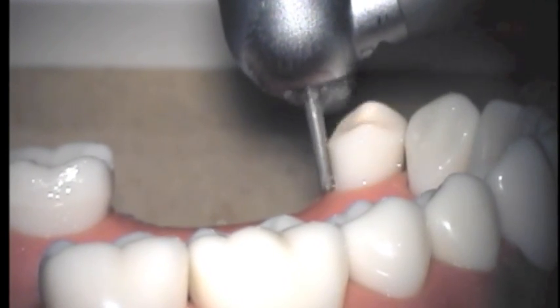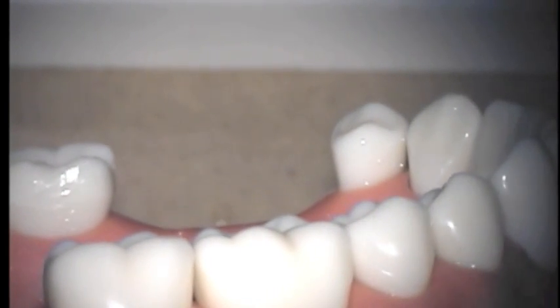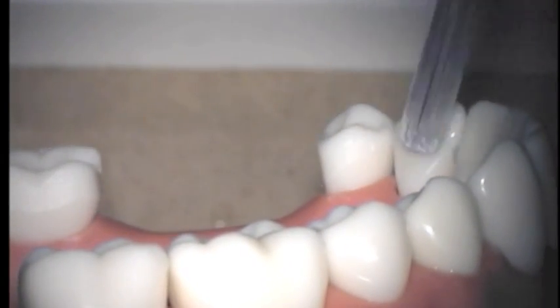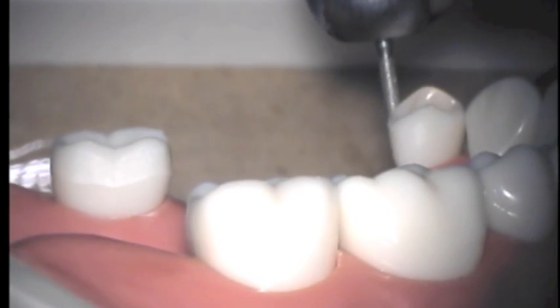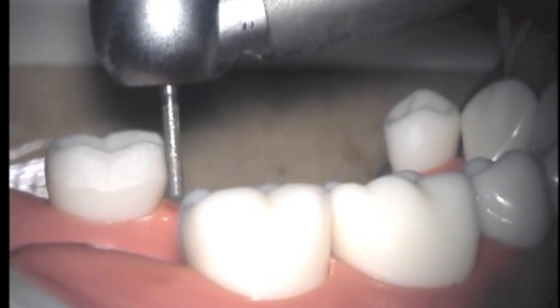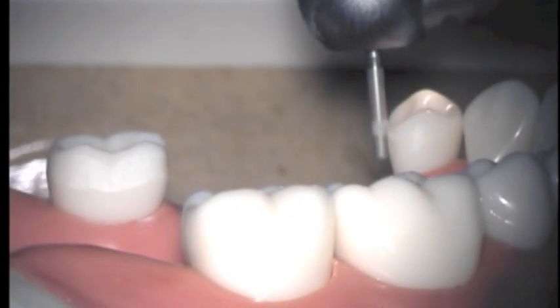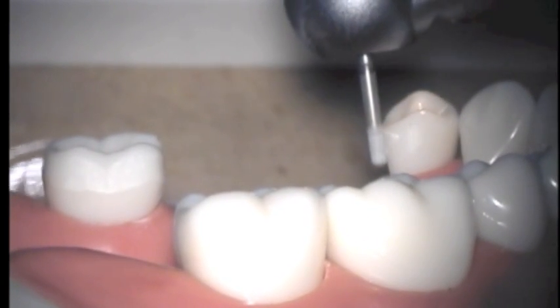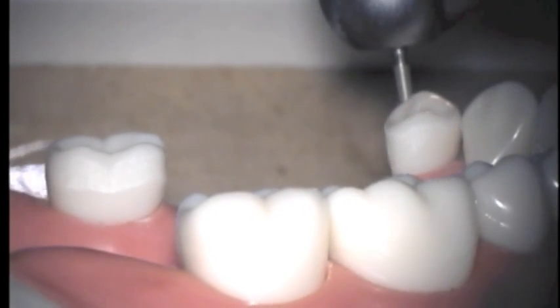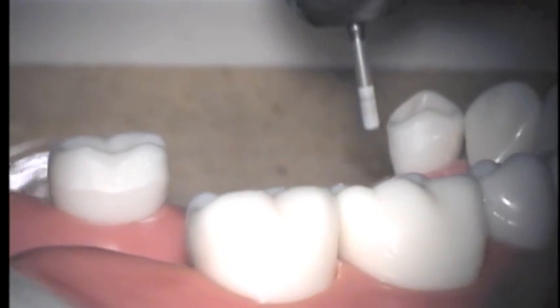Or you can use a similar technique to what we used on the first tooth. Once the teeth are prepared, do that for all the other abutments. If you're going to err, make sure that as you move toward the occlusal, things are a little bit too divergent rather than convergent — you'd rather have them draw than be undercut. Here you can see I'm going back and forth using a good steady finger rest, and I can see on the premolar I've still got a little bit of an undercut, so I'll readjust that. When finished, the guiding planes on the mesial of the molar should be parallel or slightly divergent compared to the guiding plane on the distal of the premolar.